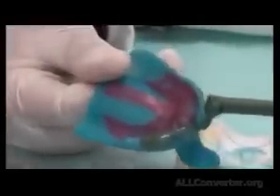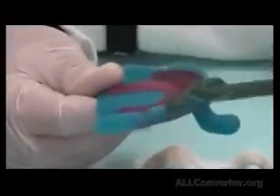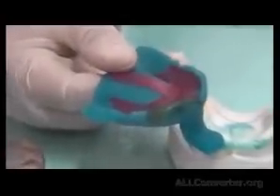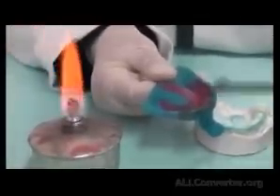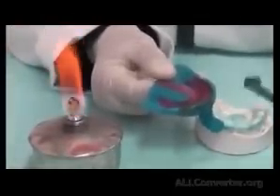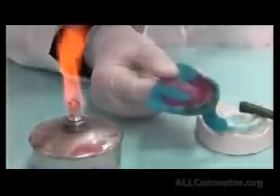Notice that in some areas I begin adding, but it's not sticky enough. This happens when it cools down. And this is not sufficient, because even if I spread it, it's still soft and spreadable, but it's not sticky to the tray. What I might face is that after adding all of this, it will simply fracture away because it had not adhered. It needs temperature to adhere. So I have added a bulk of material.